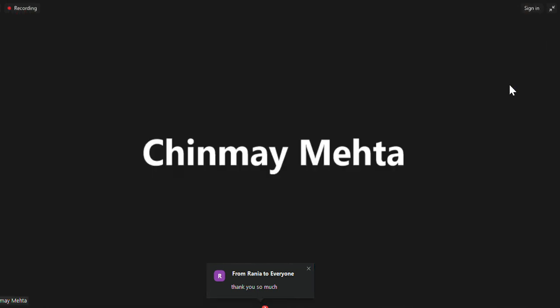The first question is how to differentiate between pleural effusion and empyema on chest X-ray. I mean, can we actually do it? Yeah, when I started my residency in India, in Assam, we had only one CT scan.